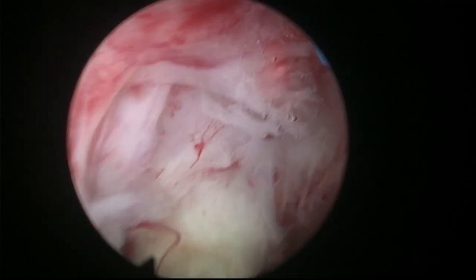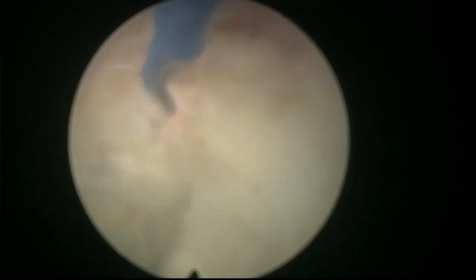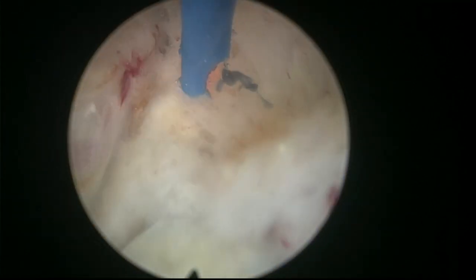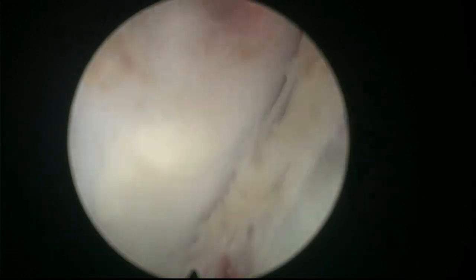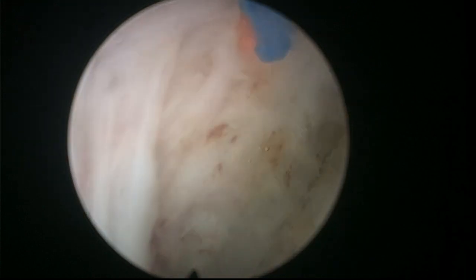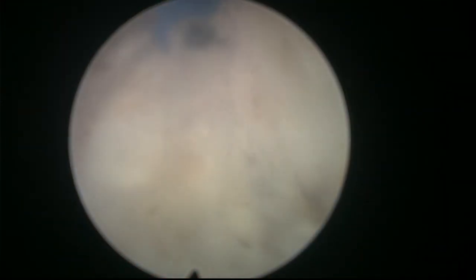So here again, this is the line of a white line. Here I'm cutting on the tissue following that white line, deepening a little bit into the adenoma. I don't mind, you see, because this is the sphincter, this is adenoma. I'm just separating those, so I have better access to the rest of the plane now, you see. And the fact that I did this cut allows me to enter there with comfort, without putting traction on the sphincter or its mucosa. There we go, again.